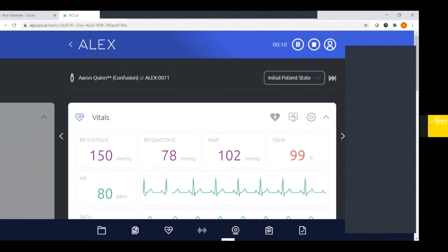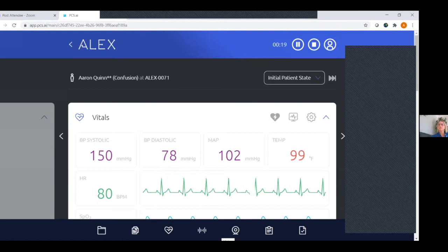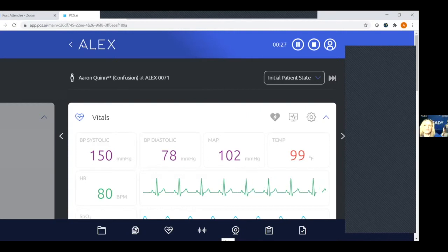I have one question from back when you did the head to toe, Angela. The question was, can we use a real stethoscope? You can. What you'll do is put a real stethoscope through, grab the scope and I'll bring it. It's actually meant to be able to use the real stethoscope with this. So you'll actually place your stethoscope underneath the sound.